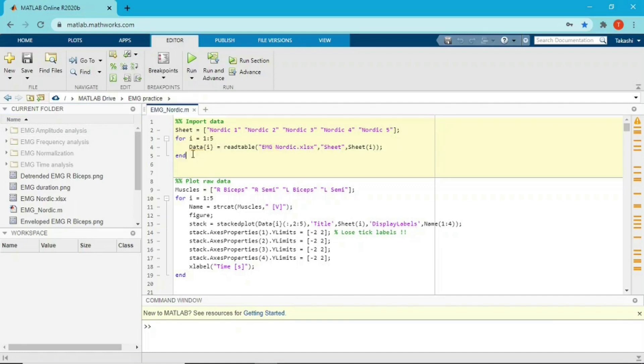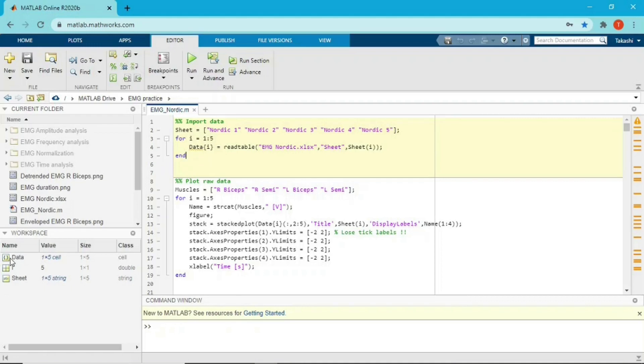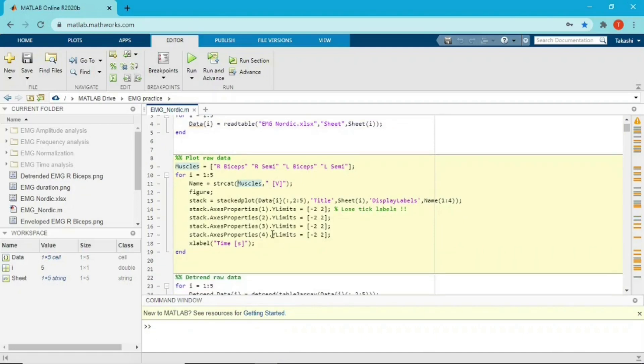So first of all, let me import the data. Okay, so I just finished importing data. Took a long time but yeah, it's already here. So you probably saw the raw data in my previous video, so I'm gonna skip inspecting the raw data. Let's dive into the plot raw data section.